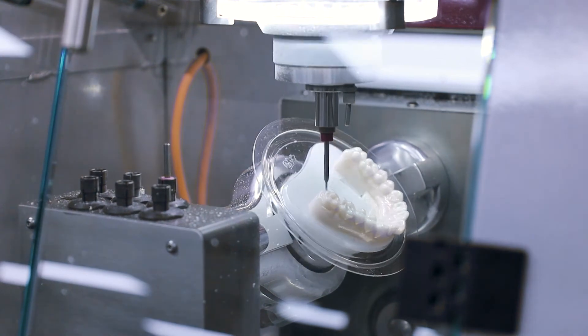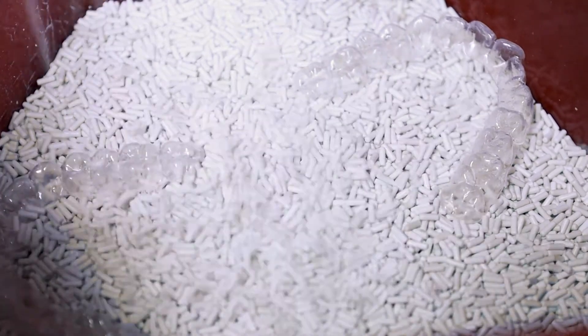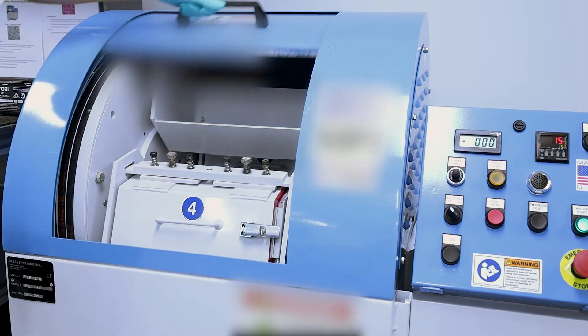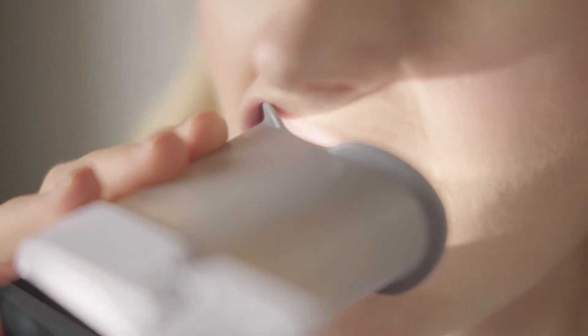These laser-printed clear aligners are placed in a secure glass component together with a robotic trimmer that accurately cuts the aligner profile. The trimmed clear aligners are separated from the model and placed inside our polishing machines, ensuring the surface of each clear aligner is smooth and comfortable for the patient.